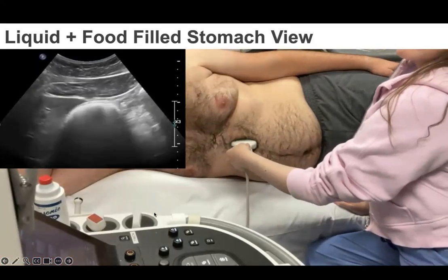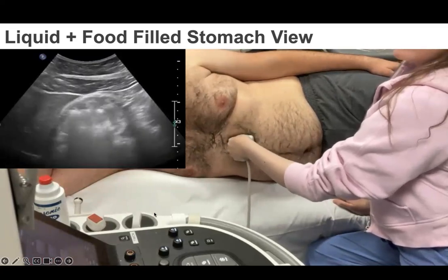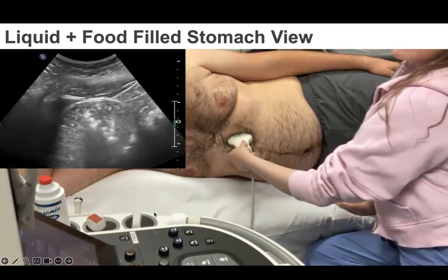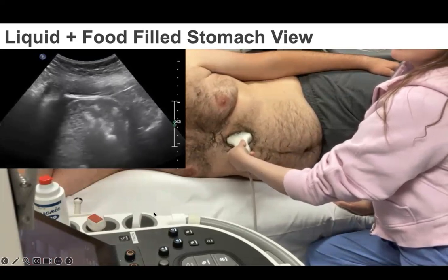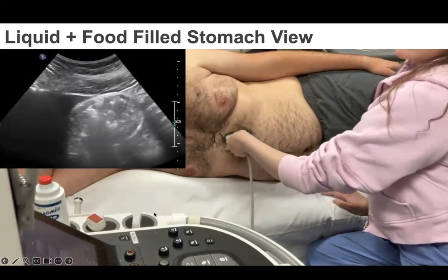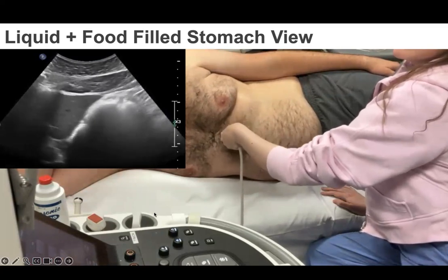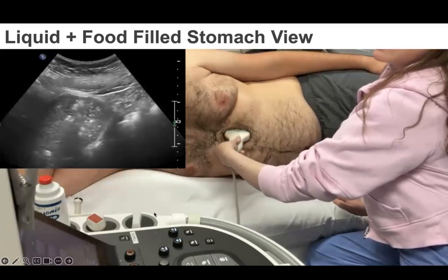The model now has both liquid, food, and air in his stomach. As the antrum comes into view, we see the classic frosted glass appearance caused by air preventing visualization. As we look further, we see various echogenicity, and we can even see peristalsis occurring, moving matter within the stomach, consistent with an above baseline risk of pulmonary aspiration. This model is clearly not NPO.